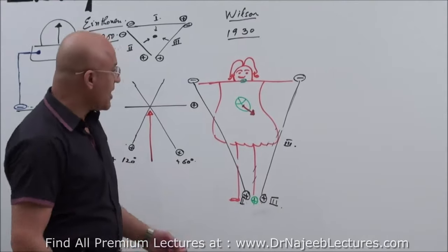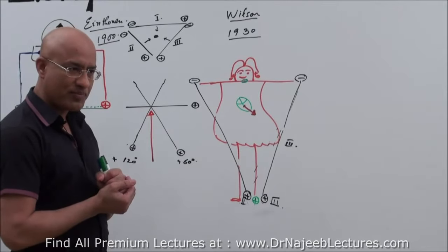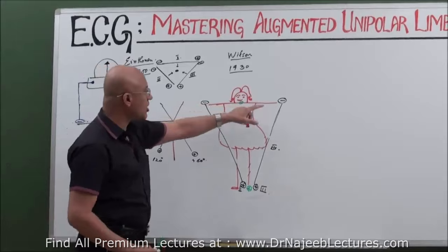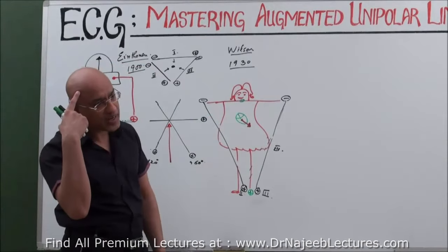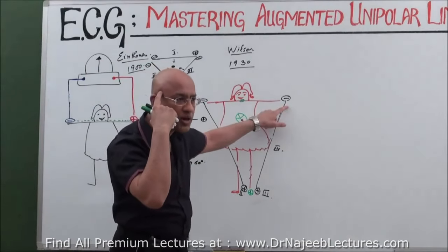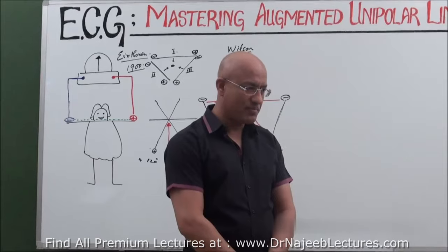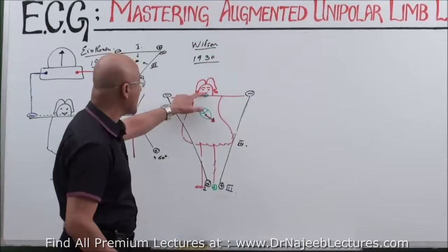You are understanding? Now, he was looking what to do. He came with a crazy idea. He thought that somehow, he should not put negative electrode on these two sides. You understand his problem? He put positive here, but then he is wondering where to put the negative. If he put negative, it is bipolar lead number 2. If he put here negative, it is bipolar lead number 3. He wanted to put it somewhere, but at the same time he wanted to get this view secretly. He didn't want to put more electrode here or here or here.